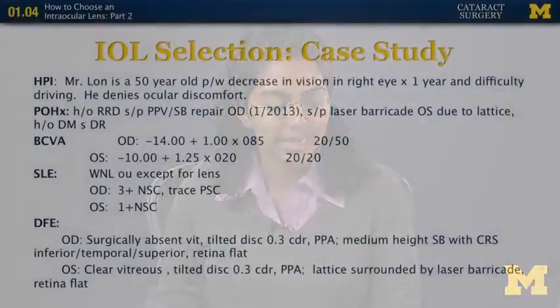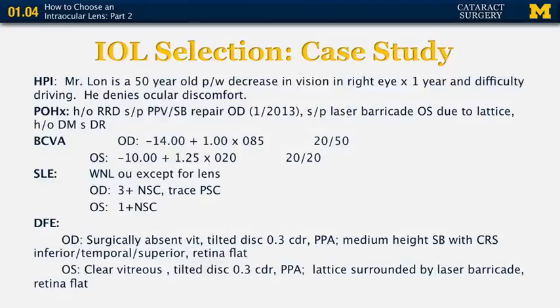Before moving on to the actual calc sheet, we want to just take in the patient scenario and see if all of it really makes sense to us. We should already be thinking about why things are what they are. And so, for example, if we take the manifest refraction, we right off see that the right eye is about 4 diopters more myopic than the left eye, -14 versus -10. We'd want to be thinking, why is that? Is there an underlying cause or reason for that? Is it maybe the scleral buckle that explains why that right eye is more myopic?